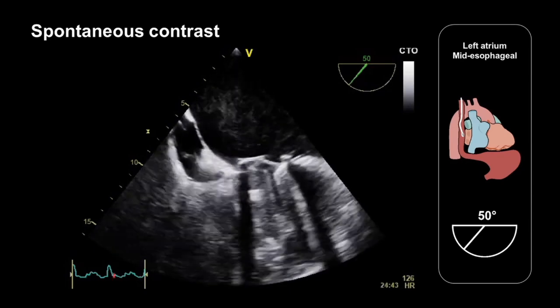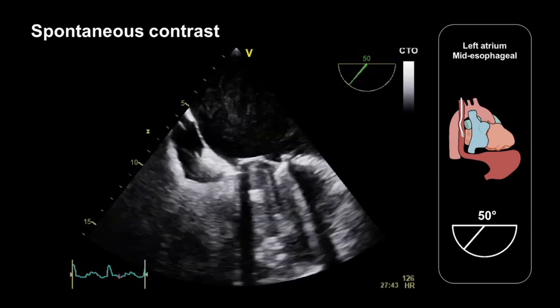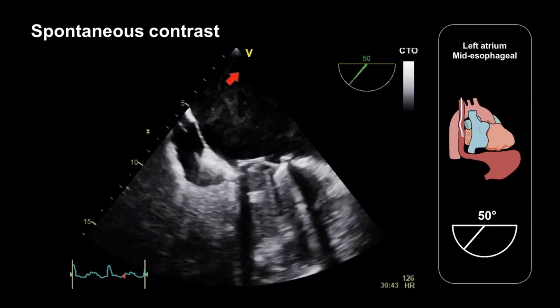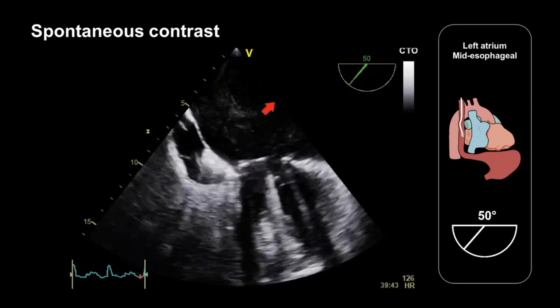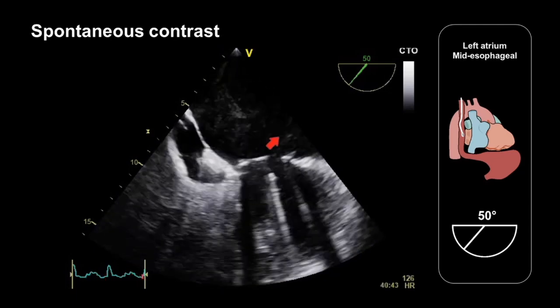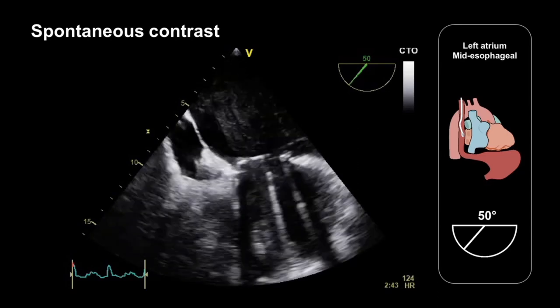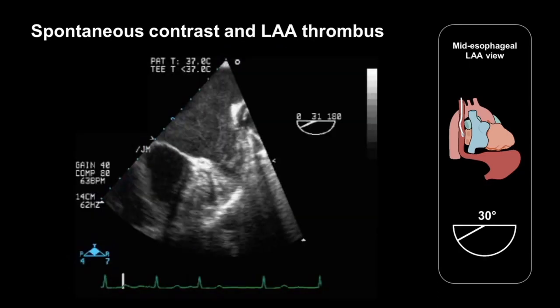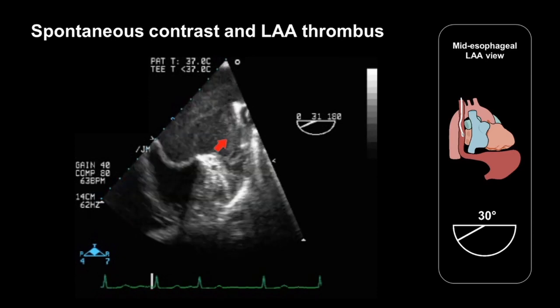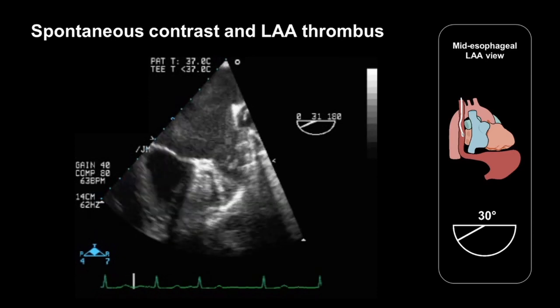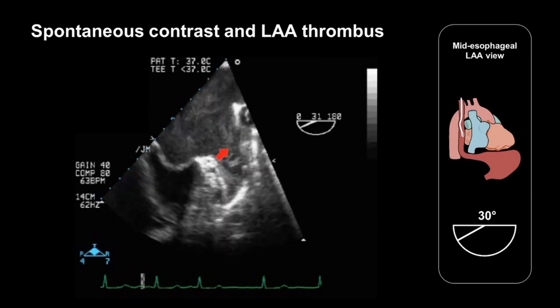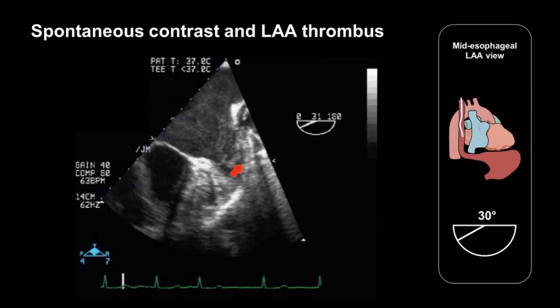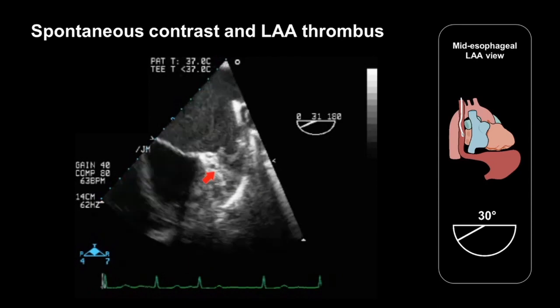In our assessment of the left atrium and its appendage we should always look out for the presence of spontaneous echo contrast — a swirling, smoke-like appearance in the left atrium consistent with a pro-thrombotic state, associated with a higher risk of thromboembolic events. This spontaneous contrast can extend into the left atrial appendage itself, and in this case — a patient with mitral stenosis — we're seeing not just spontaneous echo contrast in the left atrium and appendage but also layers of thrombus which have built up within the appendage itself.